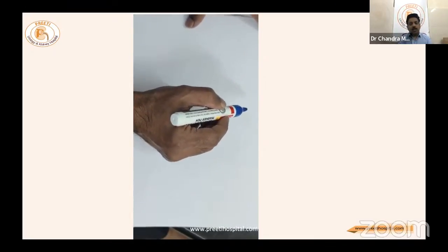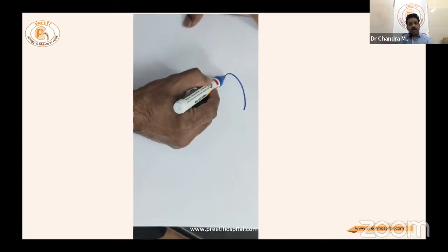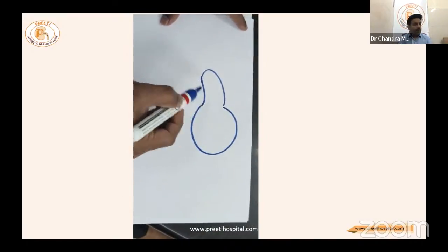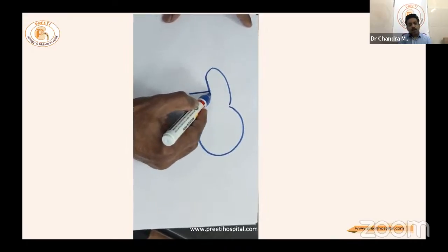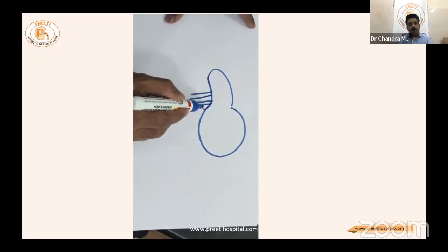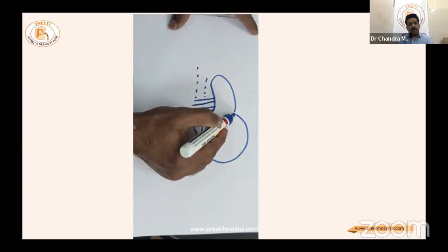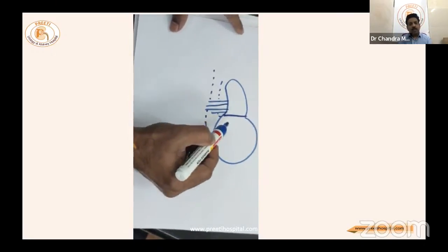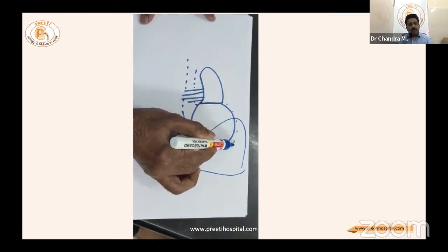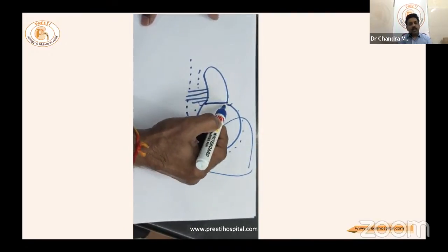In a non-functioning kidney, the upper pole will usually be dilated — a hydronephrotic kidney will be present there. The renal artery and renal vein predominantly supply the lower pole only, while a large dilated ureter goes into the upper pole. There is a dividing line between the upper and lower poles, with the liver and spleen covering the area, requiring retraction.